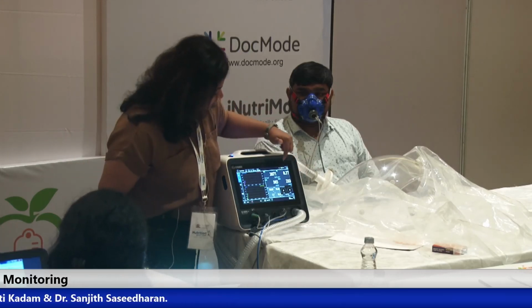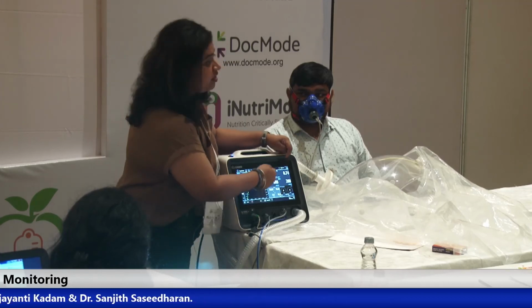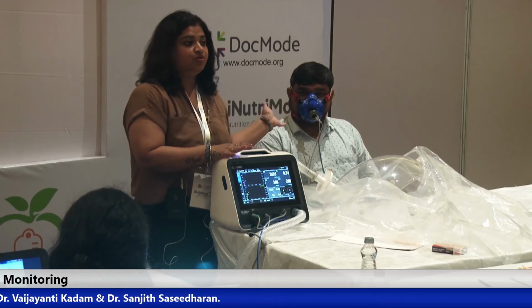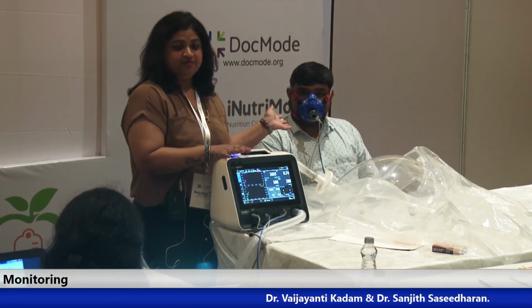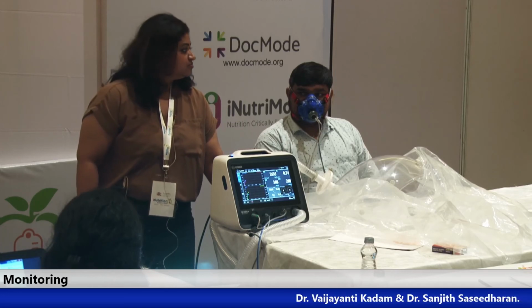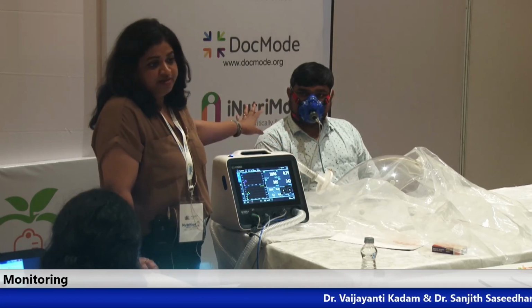So what we are seeing over here is variation is 0, and his RQ is just 0.7, which is good enough. His requirements are somewhere around 2000. So his actual requirement is 2000. As per the weight based calculation, how much is he going to require? His weight is 85, 90. So 90 into 25 comes to how much? 2200. So his requirements are somewhere around 2000 over here. That's exactly what we are looking out for.